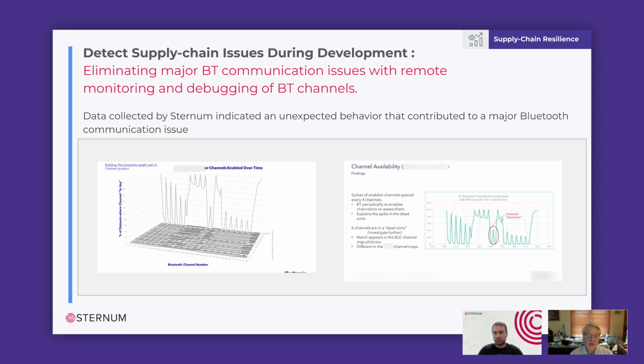And then I have no idea what happened in the environment, but in the last 20 minutes, almost all the channels were really struggling. When Bluetooth has a limit on the number of channels you can map out, you're required to keep at least 20 channels active regardless of the environment. And in this particular case, it was wiped out down to 20 channels, and they were scattered across the spectrum, which indicates that no one of the channels was really any better than the other.